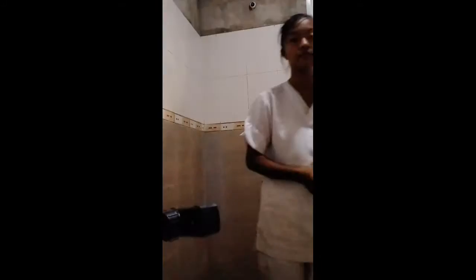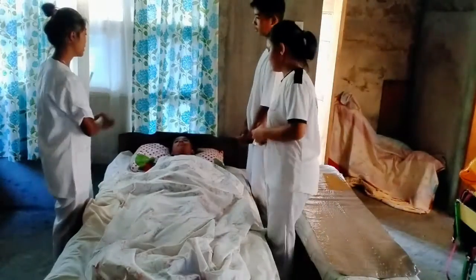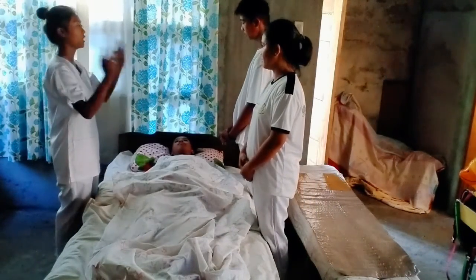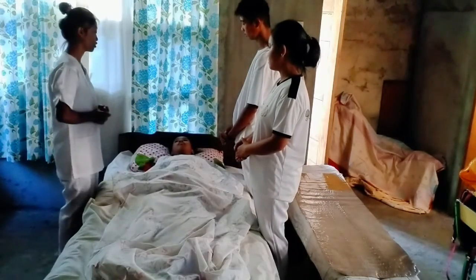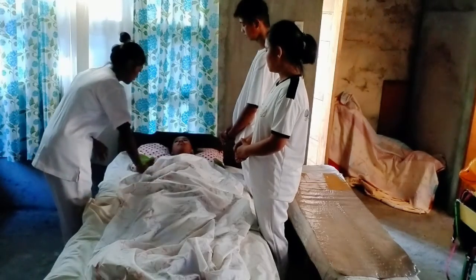After performing hand hygiene and ensuring privacy, introduce yourself to the patient and identify the patient using two identifiers. The nurse introduces herself: 'I'm Artie G. Lopez, your midwife, and we have two nurses here that will help me to assist to transfer you to the stretcher. May I know your name and when is your birthday?'